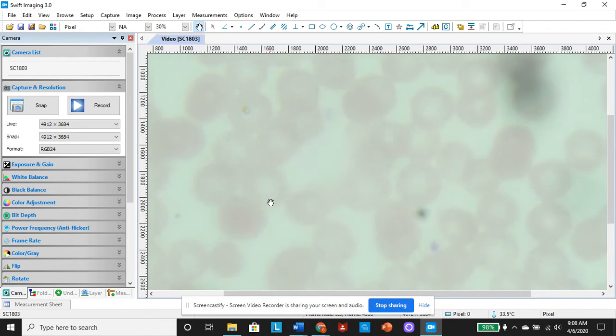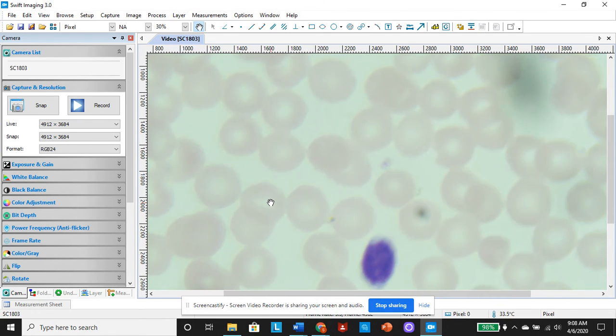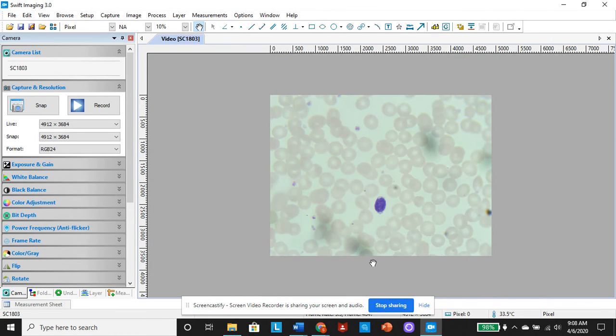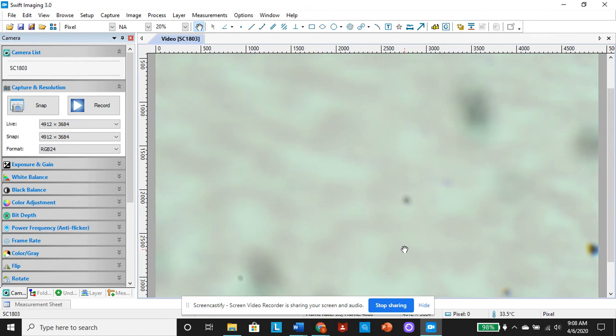All right, so the stain that you're seeing here is called a Wright stain. There's a good lymphocyte. You can see the cytoplasm right there, very, very faint on the outer edges. You can see the nuclei. It's got kind of globular, but still fine, grainy chromatin. That's one of the ways we can tell a lymphocyte when we're looking at them. Some of your lymphocytes will have, let's see if I can find some good ones.